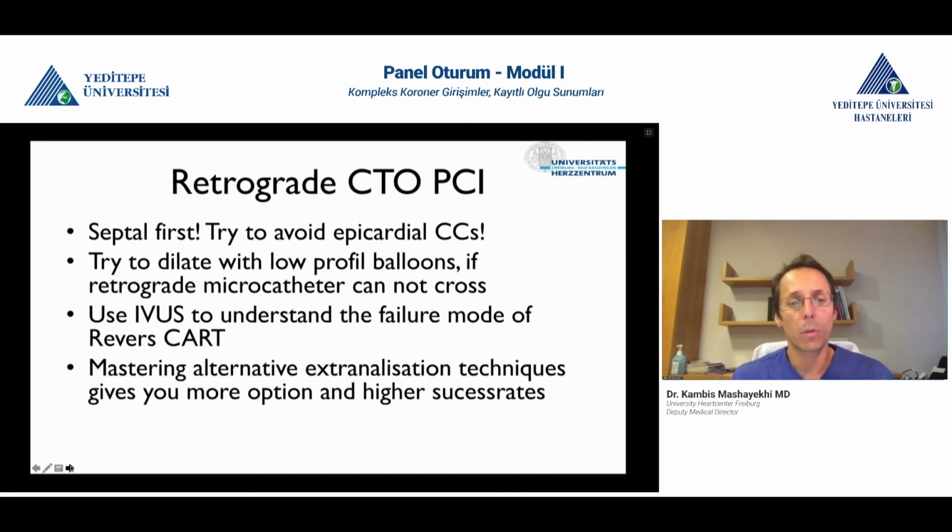And for sure, you have to master all the alternative externalization techniques to give you more options, higher success rate.